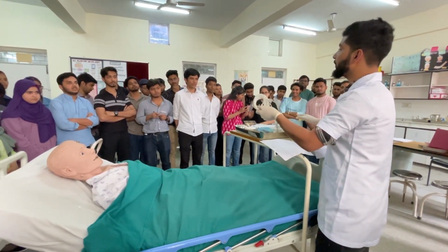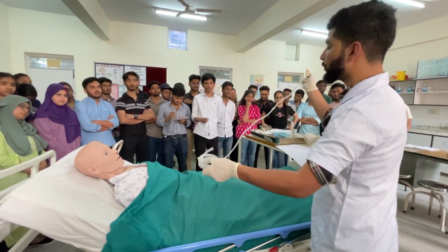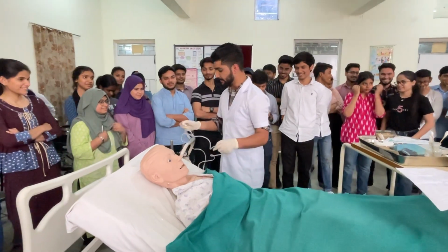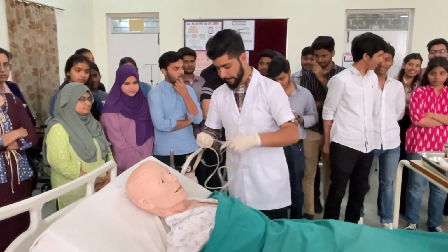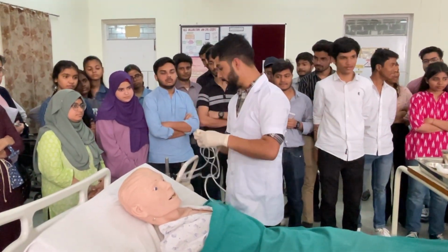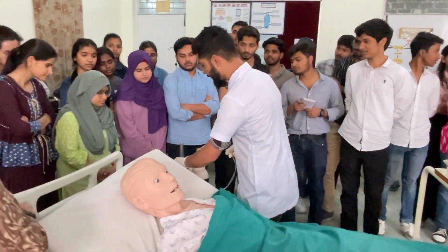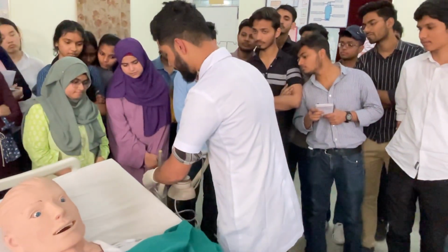What is this? This one is the nasal prong. This is not a pipe. This one is the nasal prong. This one is tubing, and this one is the connector. We have to connect this connector to this humidifier. Okay, humidifier. When we are connecting with this.